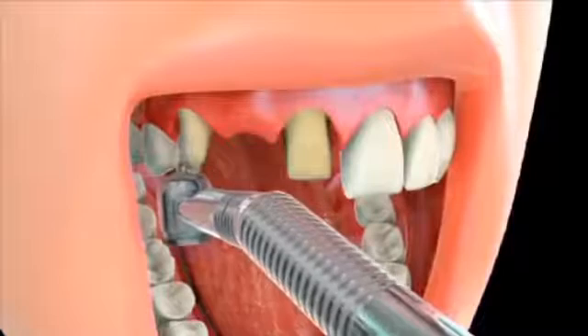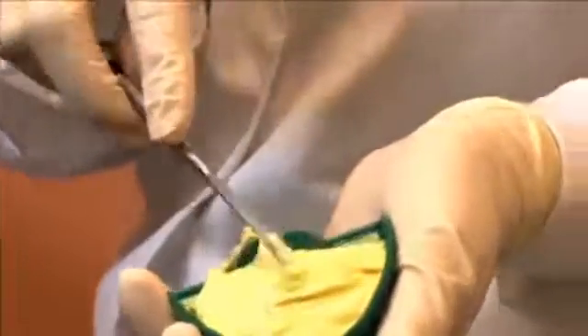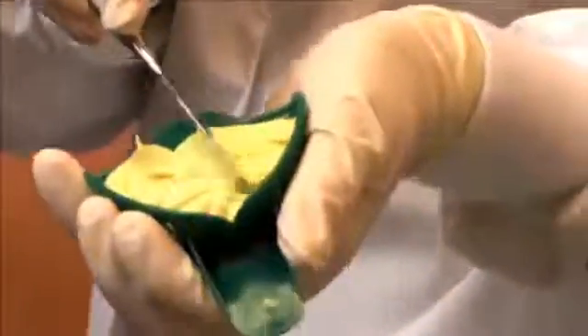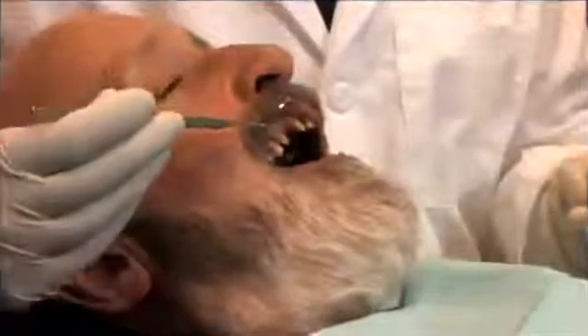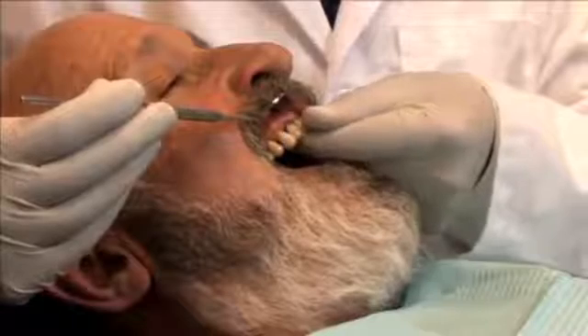These crowns also serve as holders of the pontic, which is the missing tooth's replacement. Next, an impression of the abutments, or the supporting teeth, is made so a dental laboratory can custom fit the bridge. Finally, a temporary bridge is inserted to protect the abutments as well as the space between them.